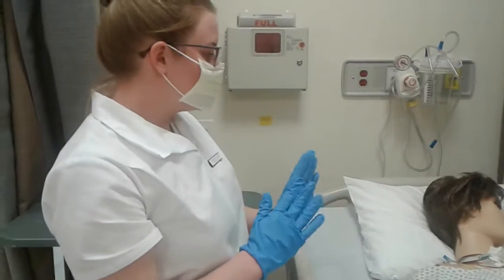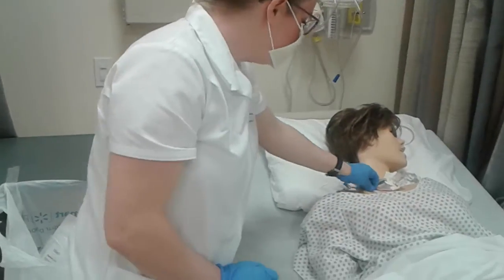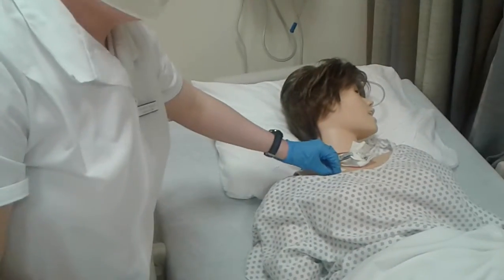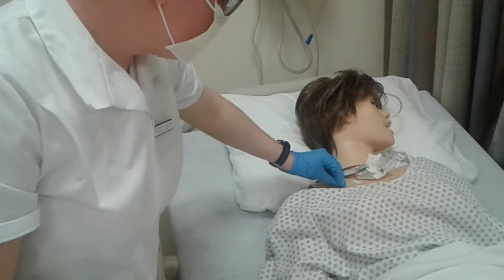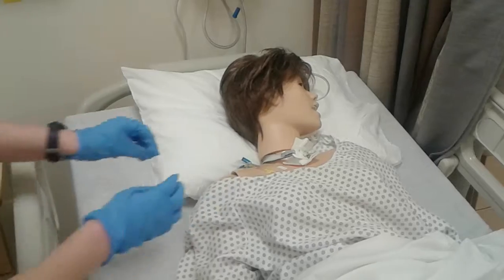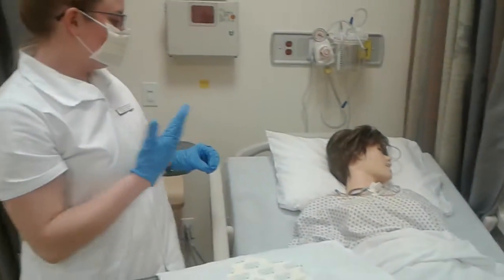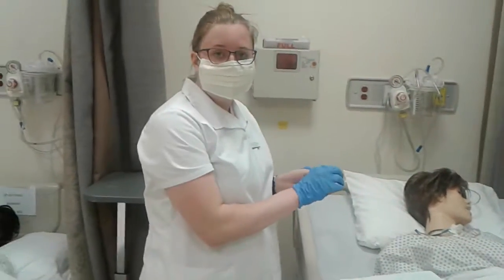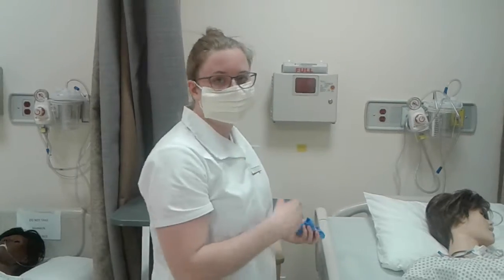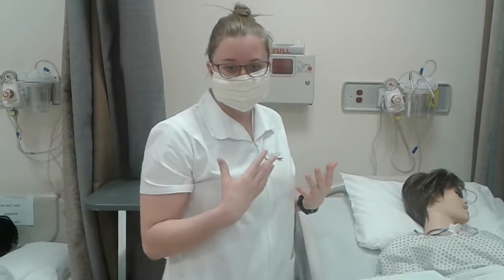So now that her head is completely turned away from the central line dressing, I'm going to begin by removing the old central line film. And I want to be very careful not to disrupt the central line site. So now that I have removed the old central line dressing, I can reassess for signs of infection, irritation, any signs of infiltration with redness, swelling, and ask her if she's having any pain around the central line.